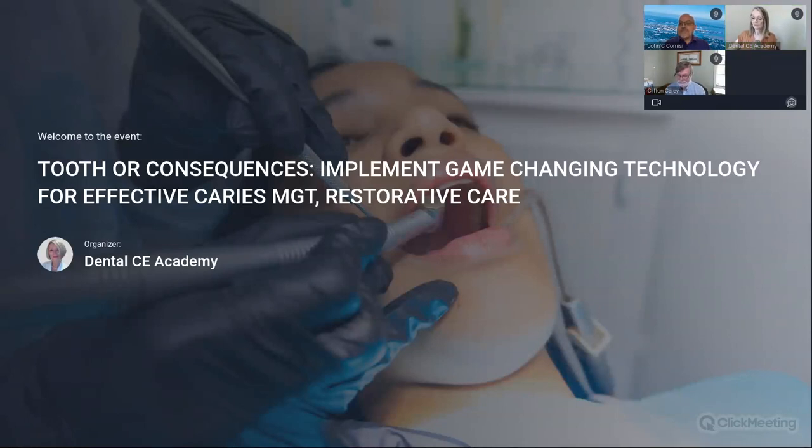I can tell you that we've looked at that in particular. And interestingly, the silver nanoparticles on the very surface of the composite may have an effect, but they tend to oxidize away and you end up not getting fresh silver nanoparticles coming out being effective. I'm not saying it had no effect. I'm just saying that we still saw biofilm on some of those composites that we tested. And I'm not going to go to bat saying they're not as effective. We just looked at it and moved on. That's the answer on the nanoparticles.